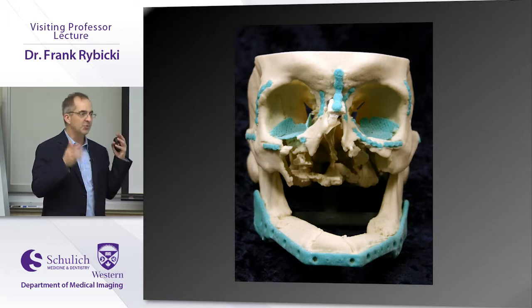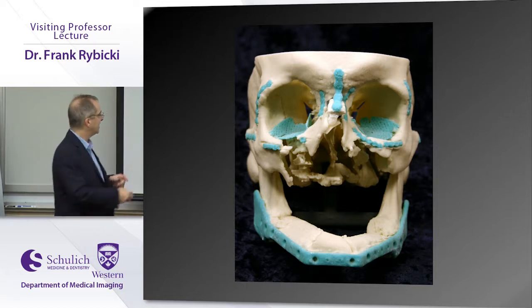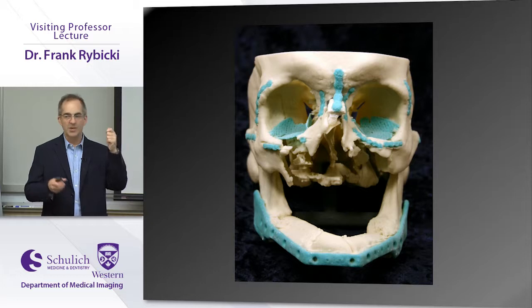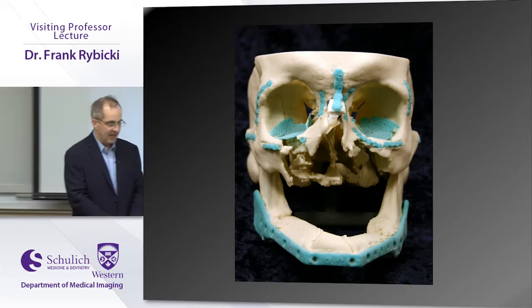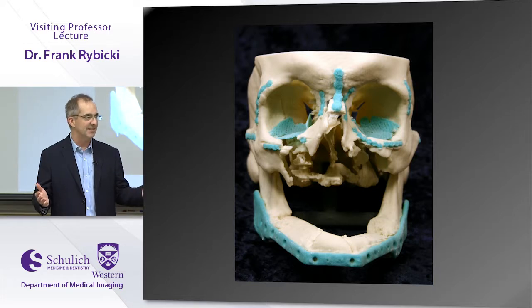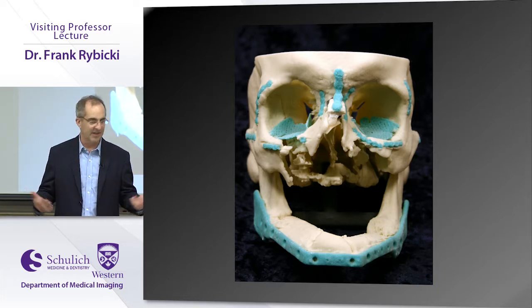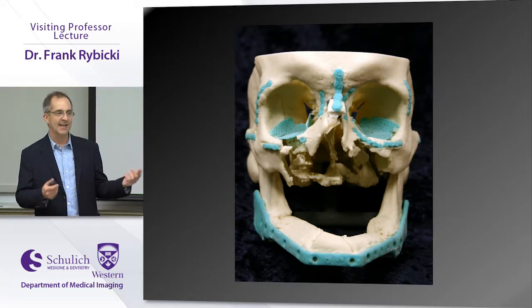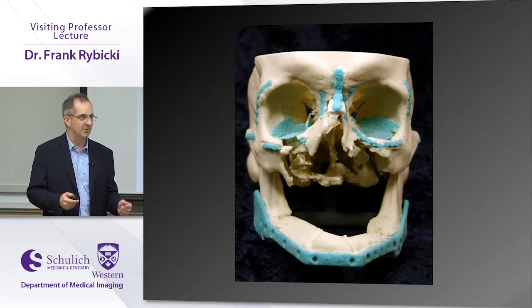So what you do is you 3D print the cookie cutter, the thing that you need to cut. And so when you actually put the fibula down in the OR, you have the device you've 3D printed. It cuts the fibula in 15 seconds, and you put it in the patient, and it fits perfectly. Otherwise, you sit there for 8 hours and bend it. It doesn't fit. You overcut it. Then you have to take out the other fibula. The whole thing's an absolute blood show.